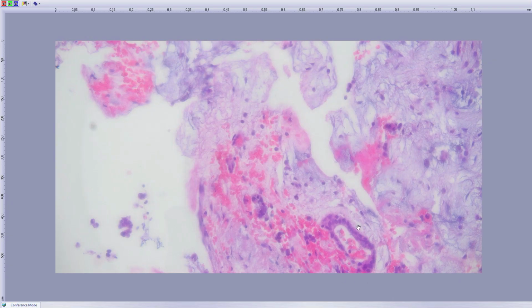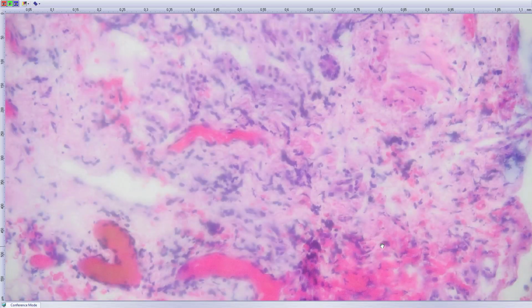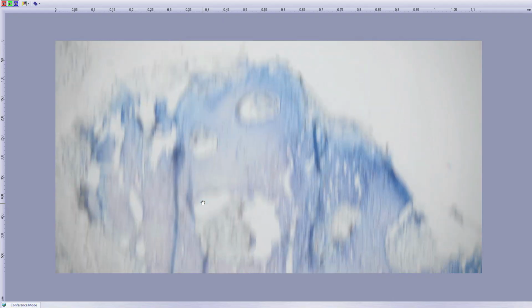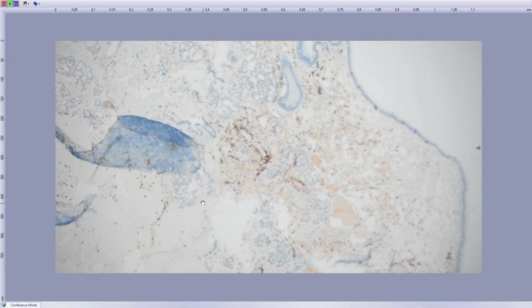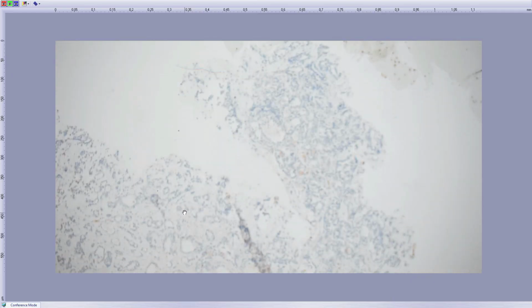Yeah, I see adenomatous structure. It will be a new type of tumor in human pathology arising on this preneoplastic lesion. We just prepared this tumor for publication. Here I have a staining for lysozyme, which is a relatively specific staining for typical adenomatous structures and hamartomas. I'm not sure whether I will be able to find the place easily. No, I can't. I would be looking for it for a long time.